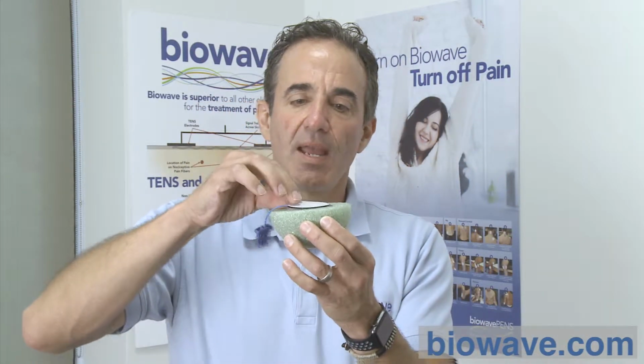And what we discovered, and we had 5 probes inside the body of the rabbit, is when you add together 2 high frequency signals, both sinusoidal waveforms, that pass through the skin into deep tissue, we discovered that when the charge at the surface of the nociceptive pain fibers, the plus charge, or the polarity of those nerves or any tissue inside the body, causes these 2 high frequency signals to multiply together. And the multiplication of these 2 sine waves causes a new spectrum of signals to form in approximately a 3-inch diameter hemisphere beneath a 2-inch diameter electrode.